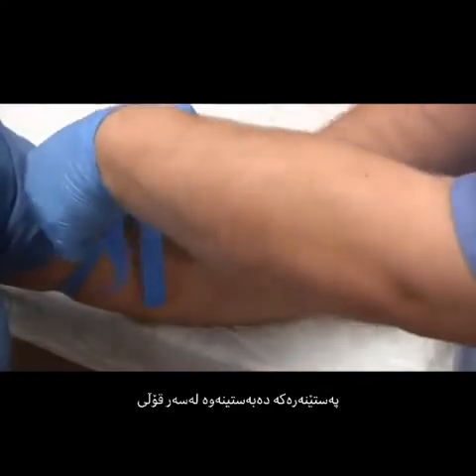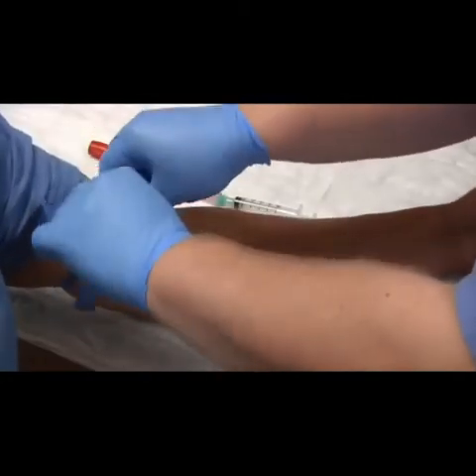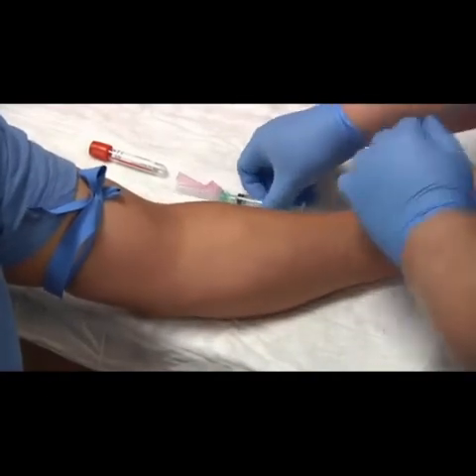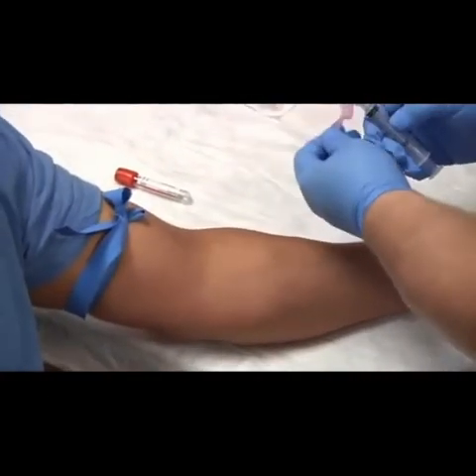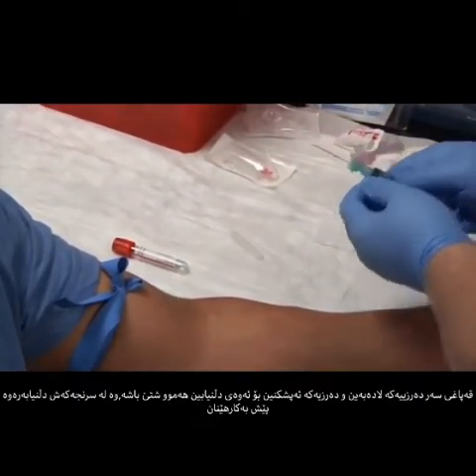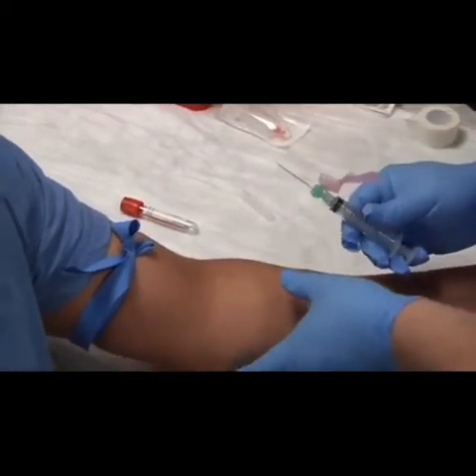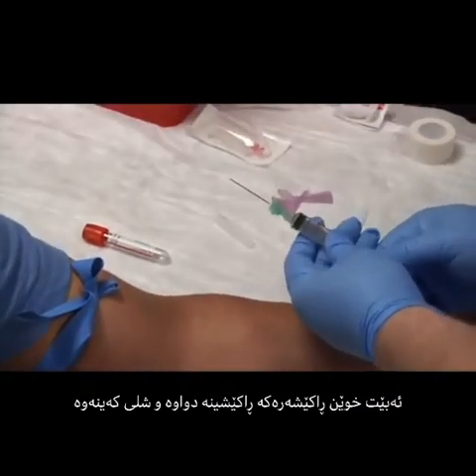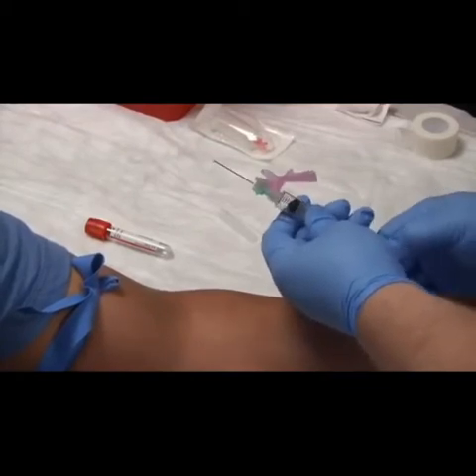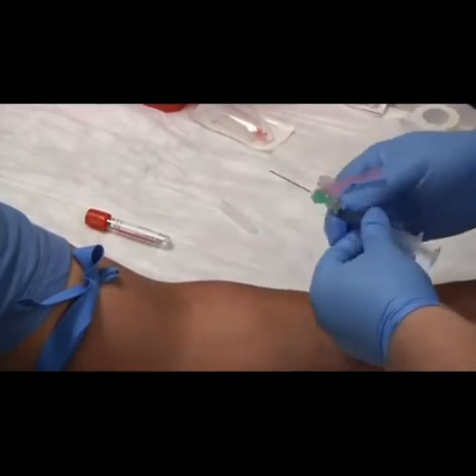Place our tourniquet and make sure that our ends are up. Have our patient make a fist. Go ahead and pull back our safety cap, release the cap down, and check our needle to make sure everything's okay with it. Also with the syringe, before you stick your patient, you'll want to pull back on the plunger to loosen it, since the needle may have been sitting for a couple of years.